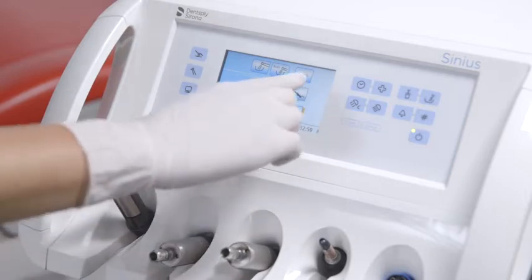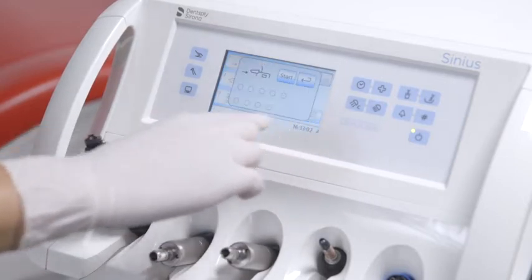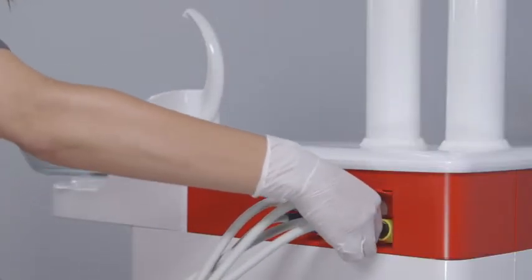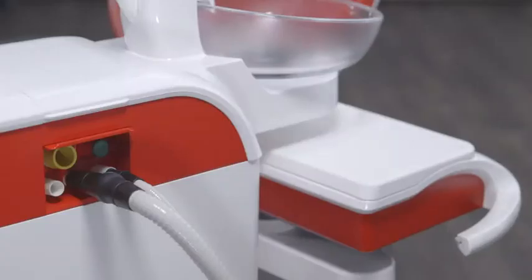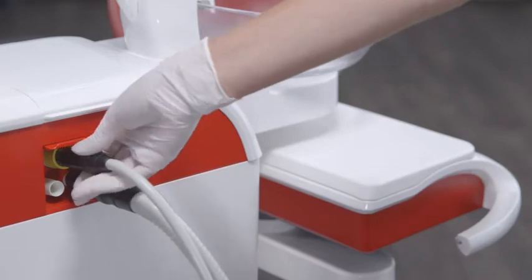Sanitize the treatment center at least every four weeks or after an extended period of non-use. Attach the instruments of the dentist and assistant elements and the suction hoses to the designated adapters in the water unit, and then press start.